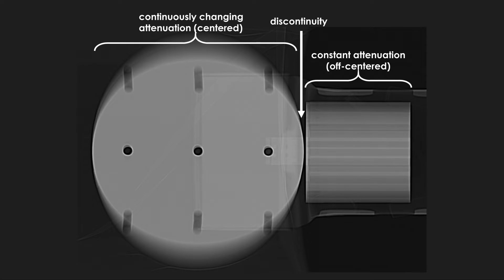Here's the scout image of the phantom setup. As you see, arranging the phantoms this way provides a dynamic target for the TCM, including a constant and a continuously changing attenuation target, as well as a discontinuity between the phantoms.